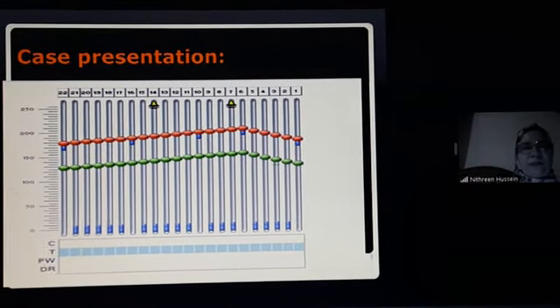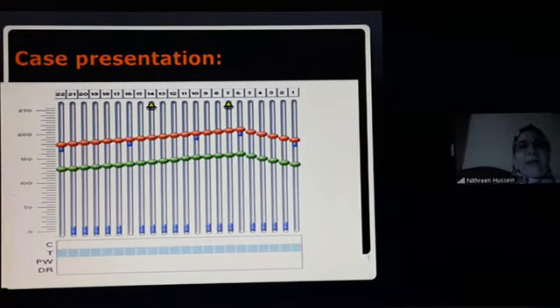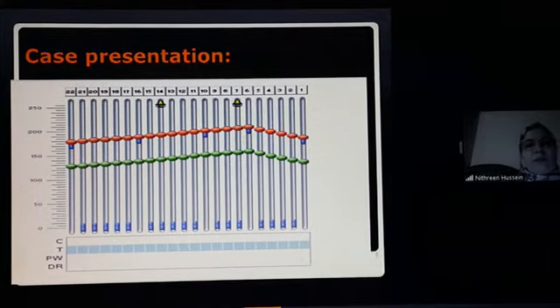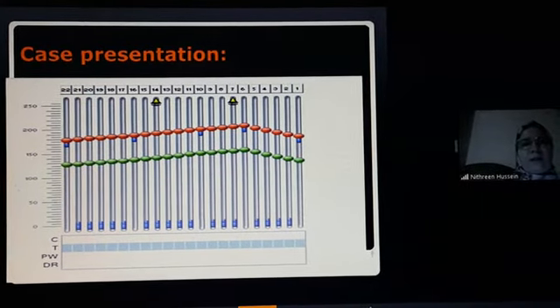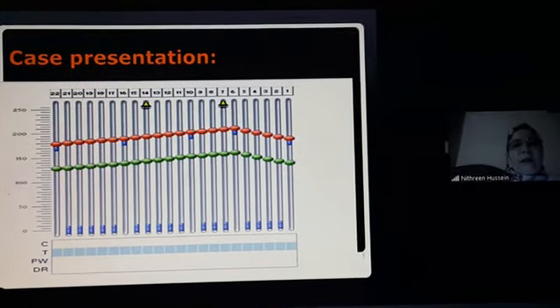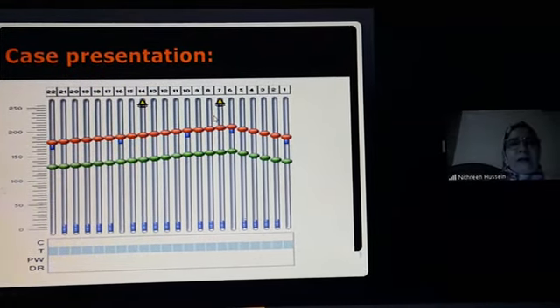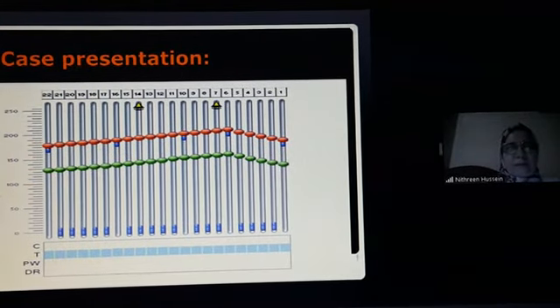This patient was referred to me. She was implanted outside our center, in Saudi Arabia, and she was using the device for 1 year. She was around 3 years old, and the patient didn't have any benefit from the device, and the parents reported that she doesn't respond to sounds.